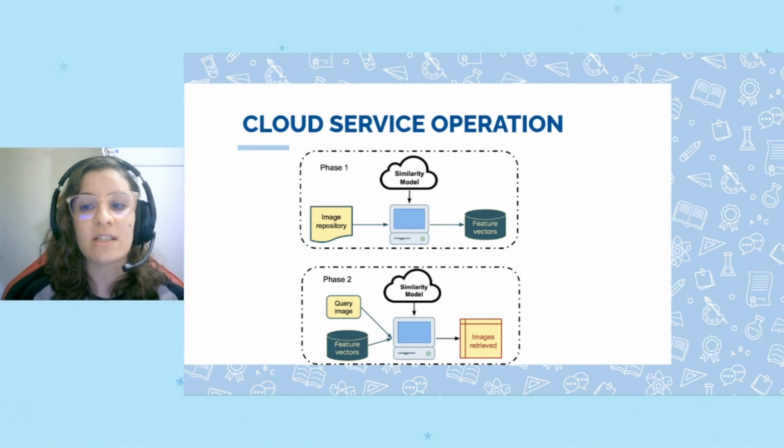Then, the pathologist indicates the database of the feature vectors for the images of interest previously built. Then the user loads the query image and informs how many similar images the system must retrieve, and the system returns k images from higher to lower similarity scores.